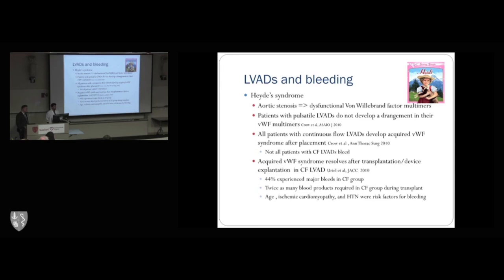yeah, as you can imagine, all the inflammatory markers get worse, like IL-6 and CRP. There are fairly good papers out there, which I can send you. But we're more interested in the profile. It's easy to say that there's going to be more inflammation after an LVAD is placed. What do you do about that, and how does it affect a patient? So much of the work that we're doing is determining what the expected recovery is for patients and how we can predict events. So what we want to do is tie that cytokine profile to an event. Okay, this is a cytokine profile that makes us suspicious that a patient will have a stroke or a thrombosis. Then we can hopefully react and prevent that event.